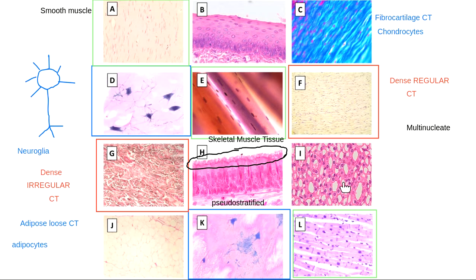And a picture over here. We are back to those little circles of cells. Which kind of tissue do I see here in I? Which kind of tissue is this one? Yep, there is my simple cuboidal epithelium.